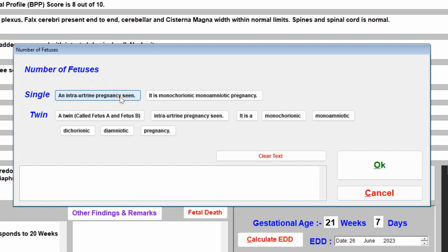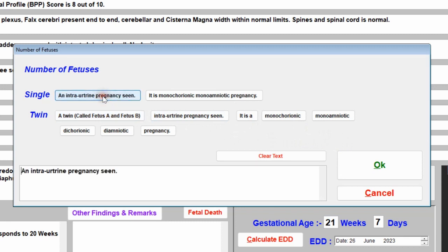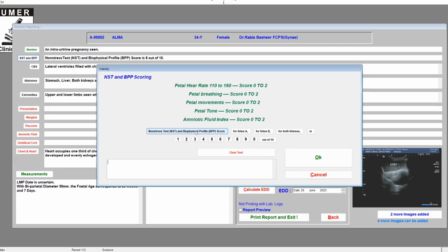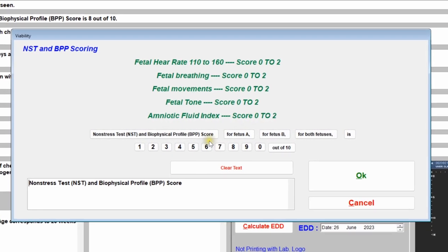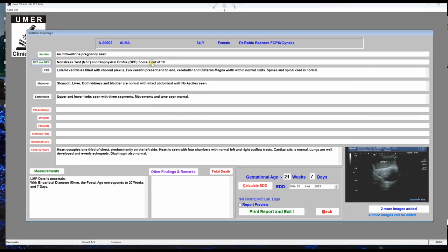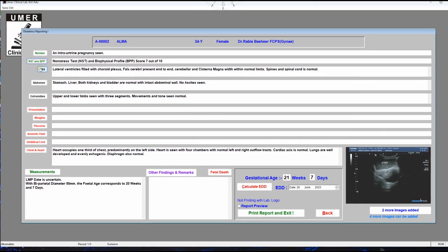For the number of fetuses, click the button and select whether it is a single intrauterine pregnancy or twin. Suppose it is a single intrauterine pregnancy — click and then click OK, and it will update on screen. For NST/BPP score, enter the score — suppose it is 7 out of 10 — then click OK and it will be updated.